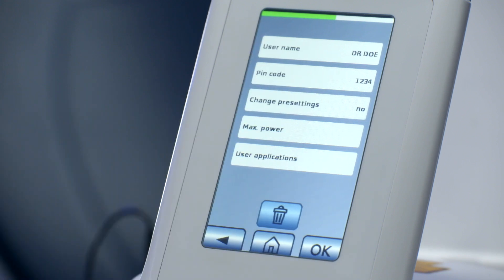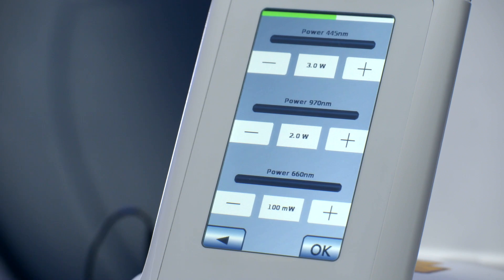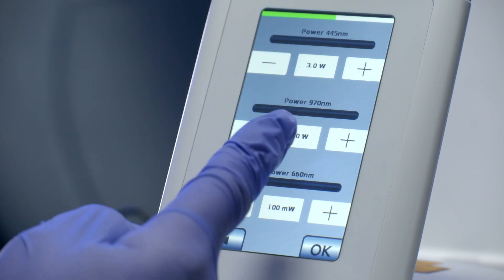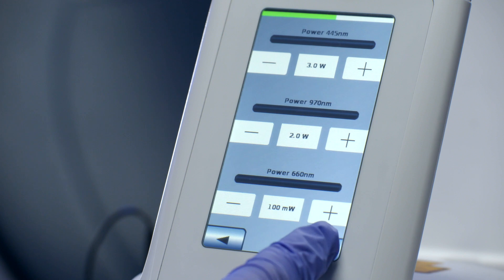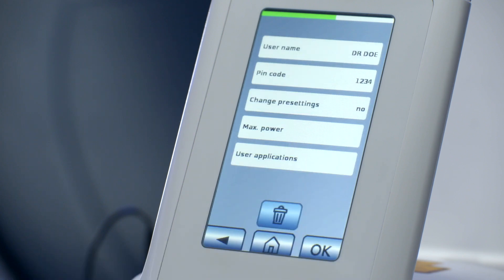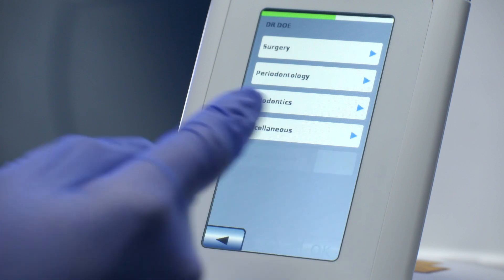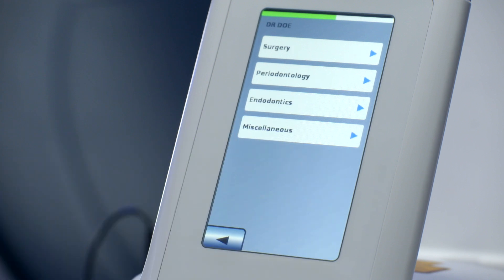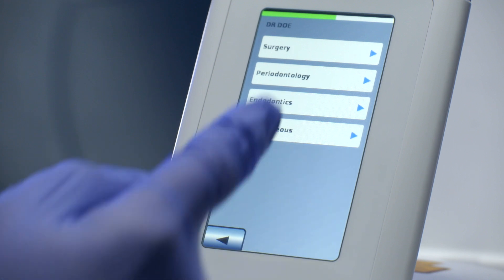Decide whether the new user is allowed to change existing applications. If no, the new user will not be able to adjust preset applications, and will also not be able to add personal applications. Decide whether the new user is limited in maximum power for each wavelength — the power limitation might directly influence the number of preset applications available to this user. Decide if only specific applications can be used by the new user.